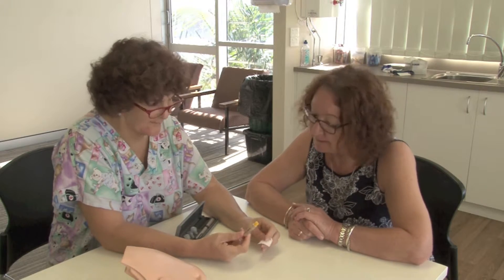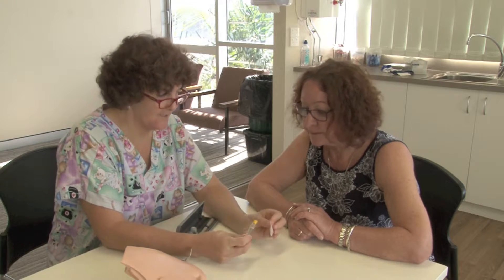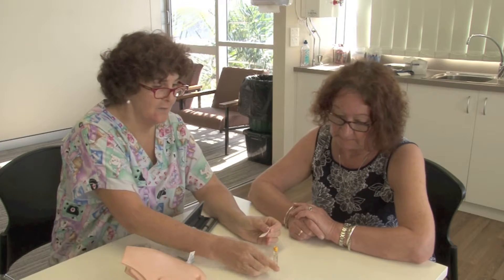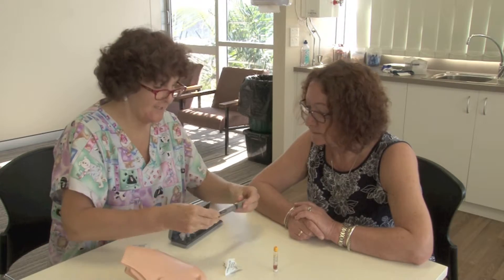Oh yes, I've got one of them. Good, they gave you one to leave. So what we're just going to do is get an alco wipe and wipe the end of the cartridge before we load it into our little pen here. We'll do that first and give it a little minute to dry. And then we get our pen.